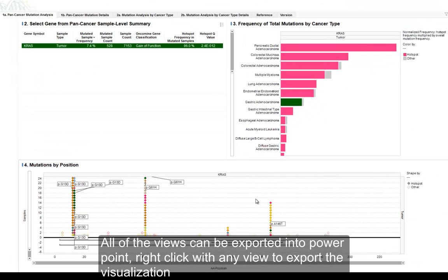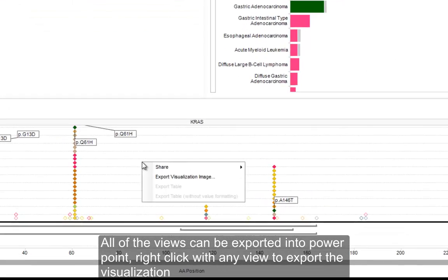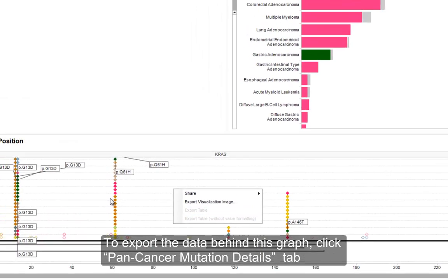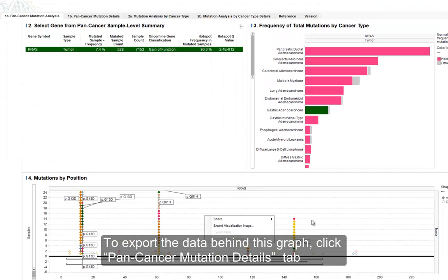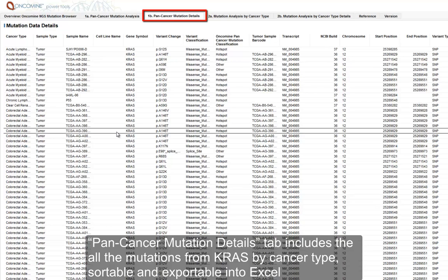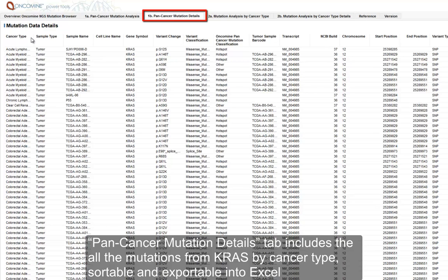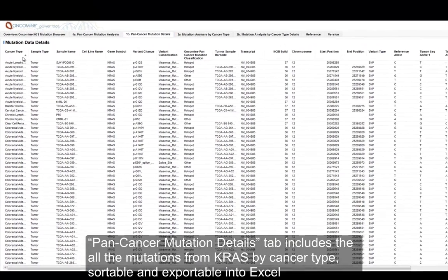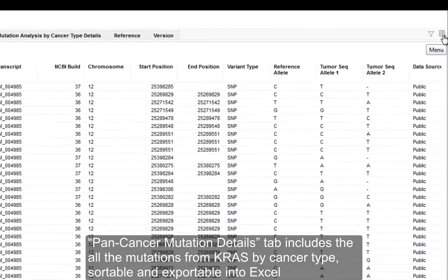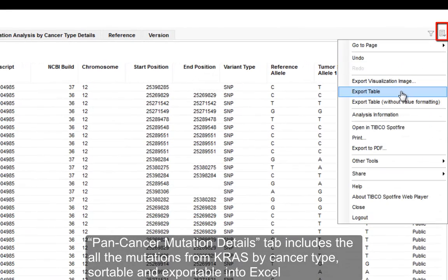If you are interested in taking any of these views and putting them into a PowerPoint deck, you can right-click within any view and export the visualization. Or if you'd like the data behind this graph — behind the mutations by position — you can click on pan-cancer mutation details. That brings up the full list of all the mutations from KRAS by cancer type, which you can sort in any way you'd like and also export into an Excel spreadsheet. In the top right-hand corner, you can export the table with or without formatting.